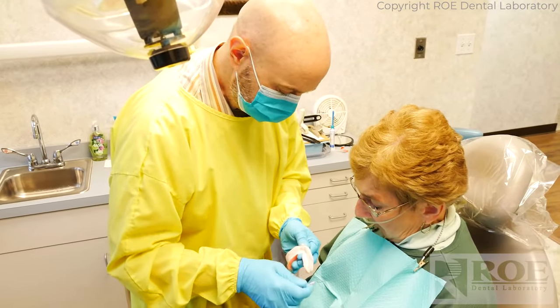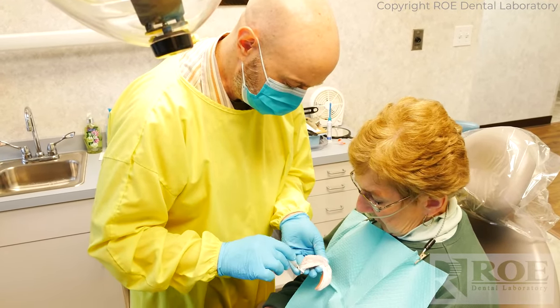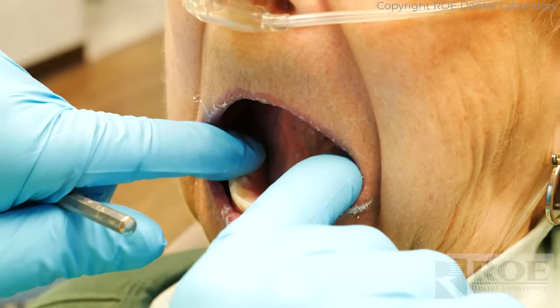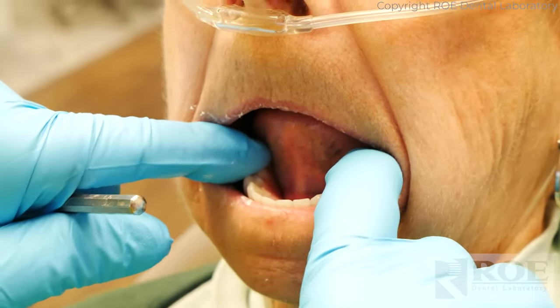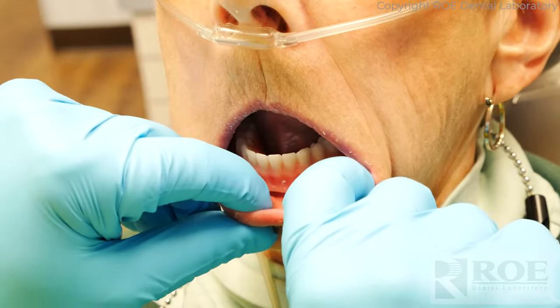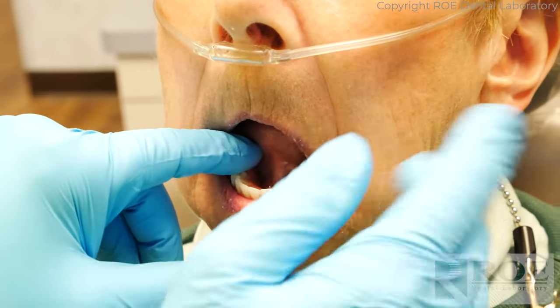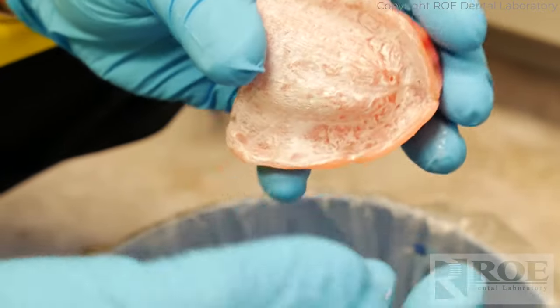Where did I say it's going to be? Right here — that's right, guaranteed. There you go. You're not even in the way. You can close halfway if you wish. I'm holding it and I do this — get some suction out of that. You can rest.